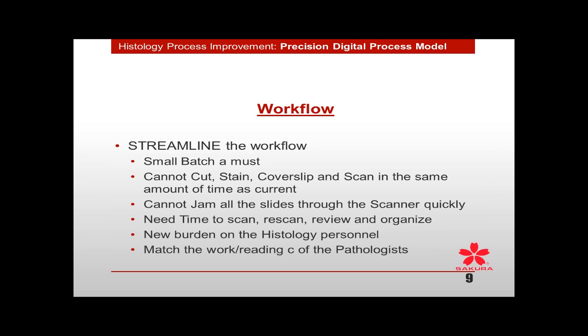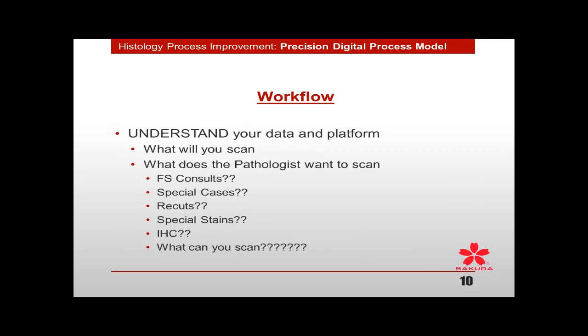Now that you've added even one digital image to the glass slide, you've doubled their viewing time, whether it's a few seconds or multiple minutes. You may be adding multiple images, so you've got to be able to match that workflow with the reading capabilities of the pathologist. So streamlining the workflow, starting with the big picture and then working through it, is very, very essential. So you have to understand your data and platform.